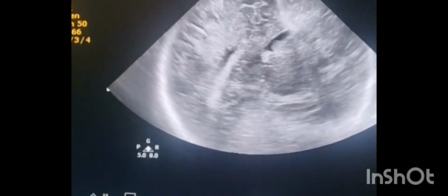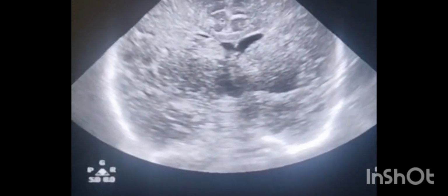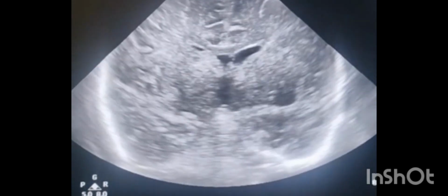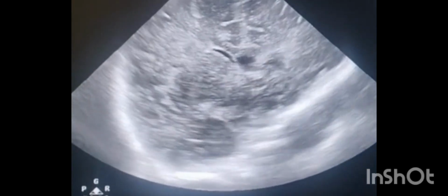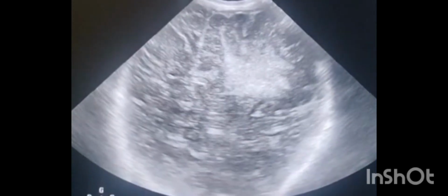So in this baby, you see the pathology. The history showed decreased fetal movement, then required intubation, cardiac dysfunction, and then coronary artery dilatation. And you can see this pathology here, the hyperechogenic shadow. So what exactly do you think? It is definitely a multi-inflammatory syndrome, and that fits into what is called MIS-N.